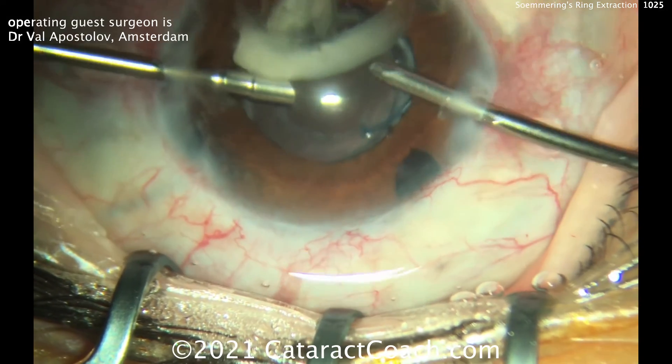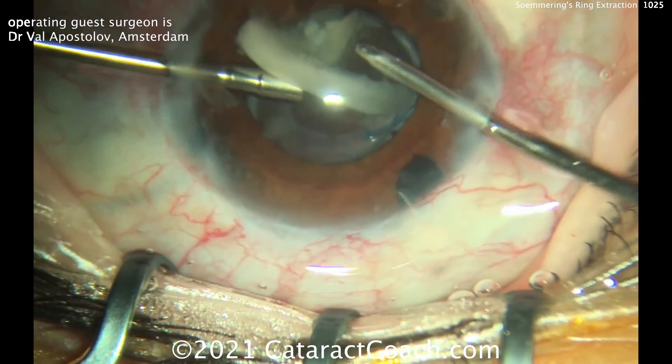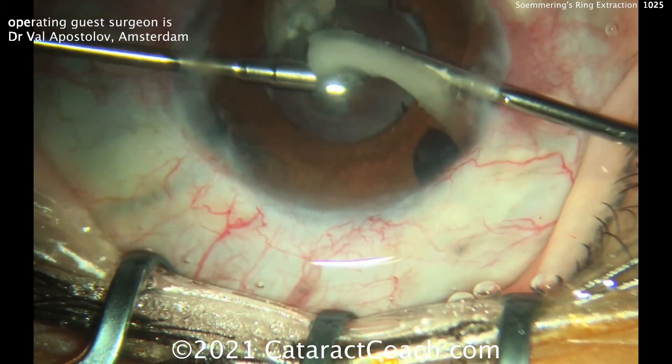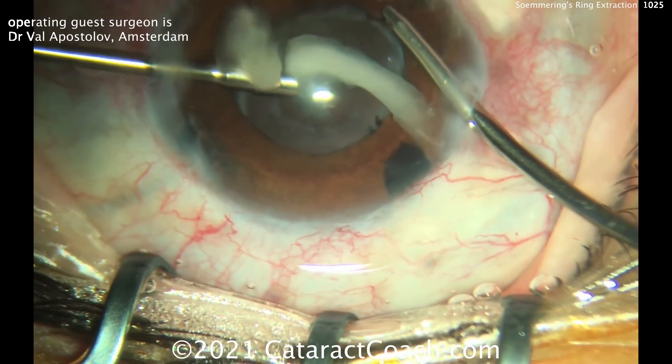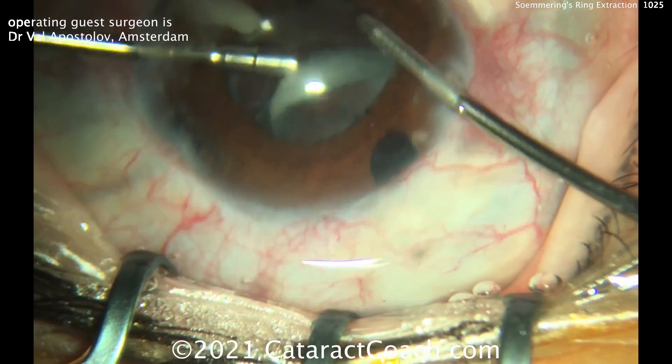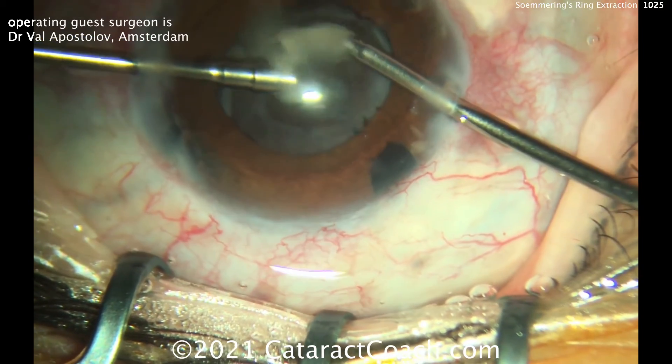The outcome was nice. This video is worth sharing because this is not something we see often — you're going to do less than one in a thousand cases involving removal of a Soemmering's Ring. But just so you've seen it before and know how to do it — thanks, Val, for some great video.